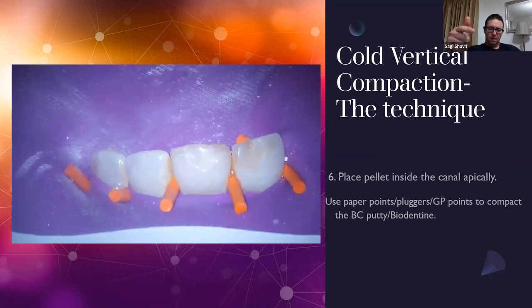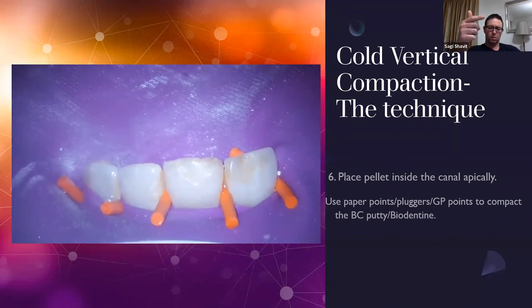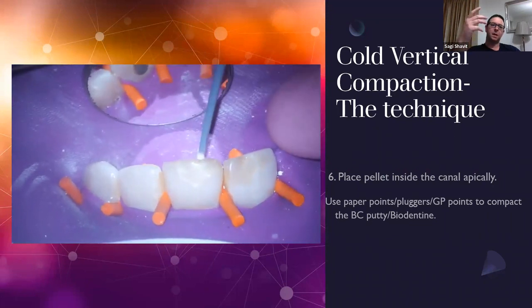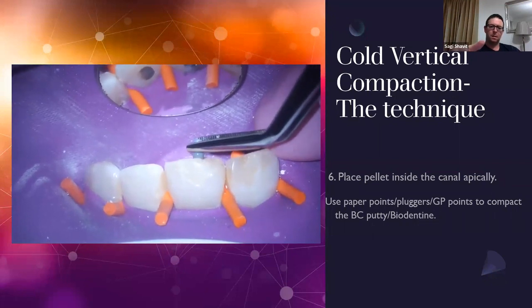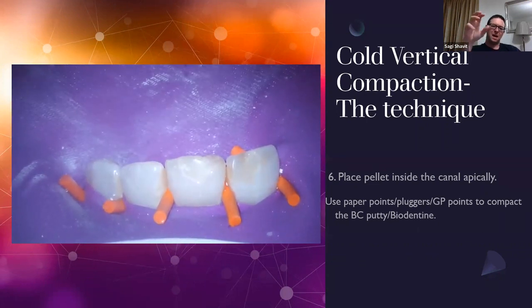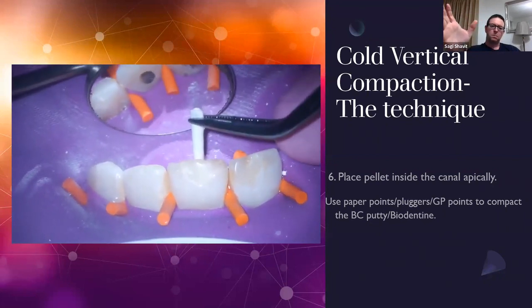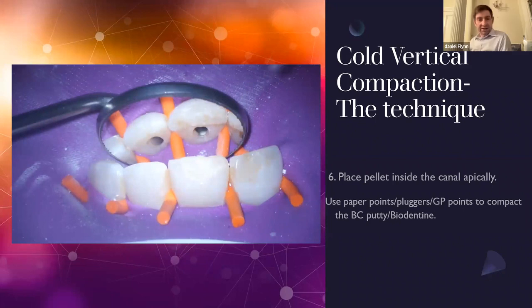Now I filled another hole, a bit bigger. So if I use the size 1.2, let's say, I'm putting in 1.3 and maybe 1.4. And again, I've got another pellet ready. So it's all quick. Take it, put it again. I know where it is, okay? Also, just interesting to show, the access cavity is as wide as the GP point. You don't need to go wider. Okay, and I compact again.